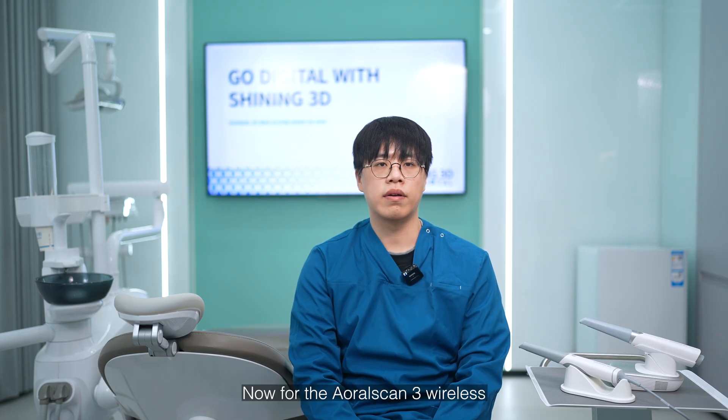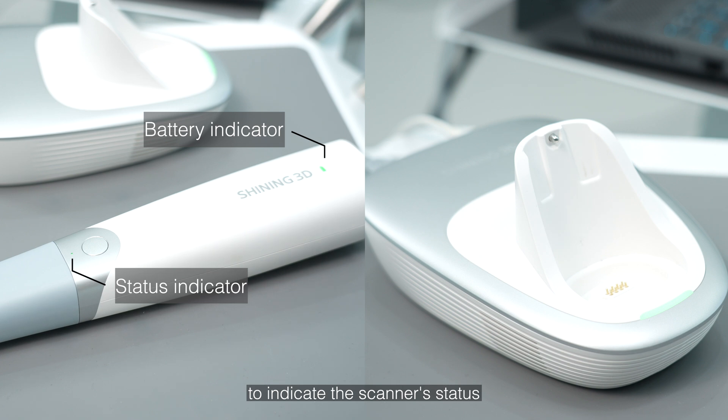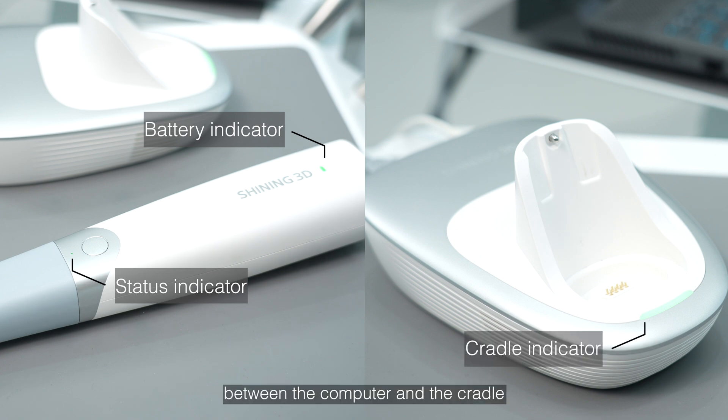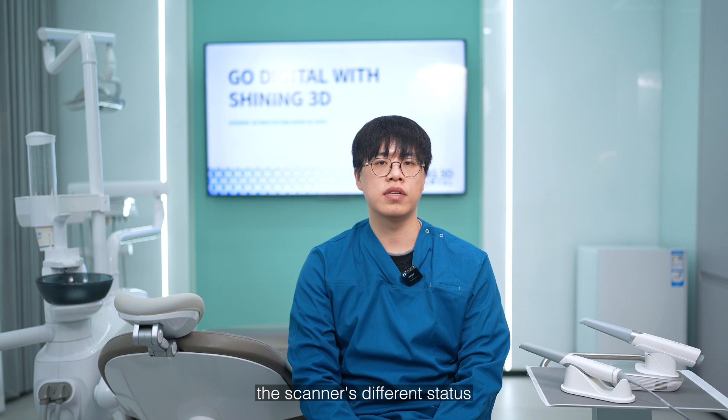Now for OroScan3 Wireless, there is a lamp on the scanner indicating the battery status, a small dot light on the device to indicate the scanner status, a light on the cradle to indicate the connection status between the computer and the cradle, and the software provides various indicators to display the scanner's different statuses.